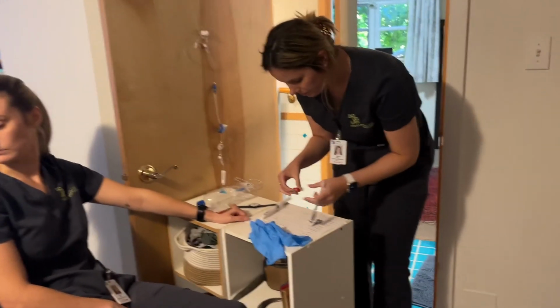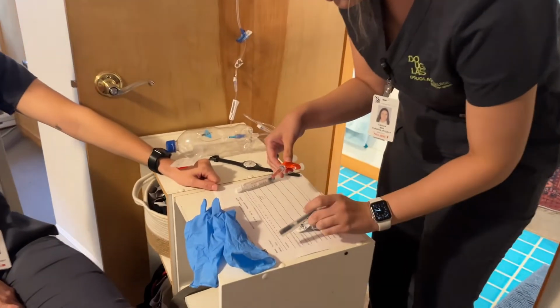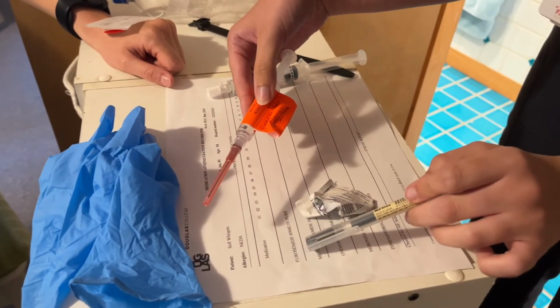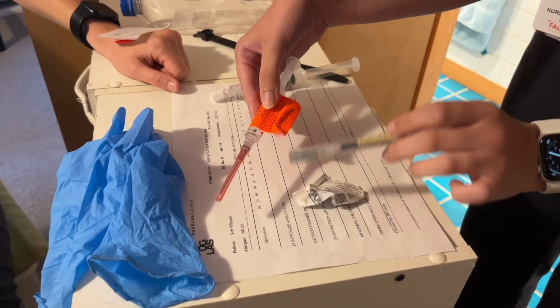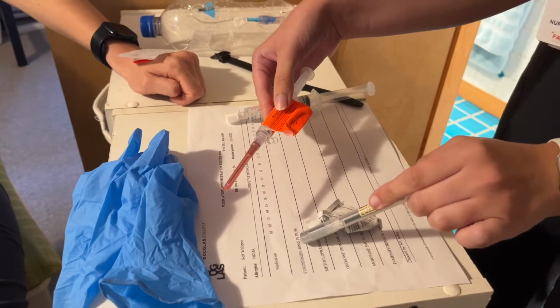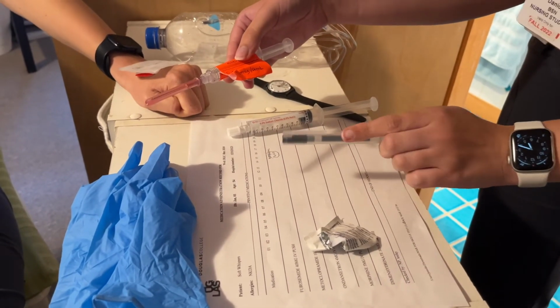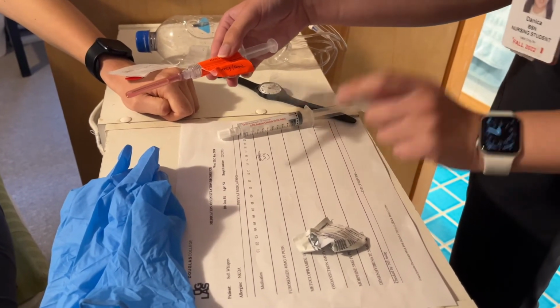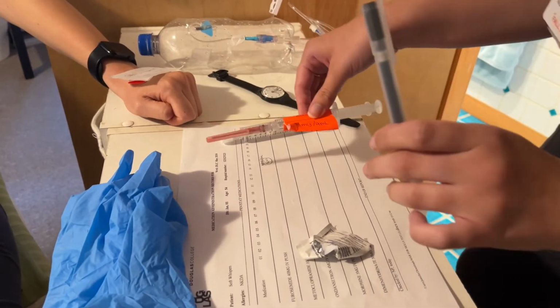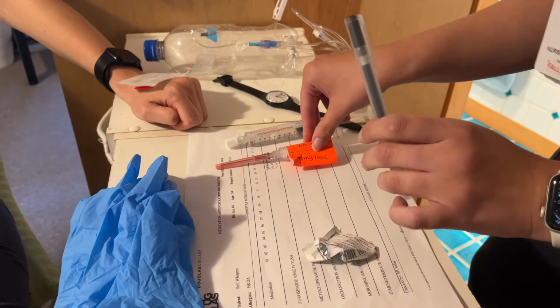So, we have the right patient. We have the right medication, furosemide. We have the right dose, 40 mg per 4 ml. We have the right route, IV. Right frequency is once, and the time is 1600, and it's for her congestive heart failure. So I'm just gonna put that down.